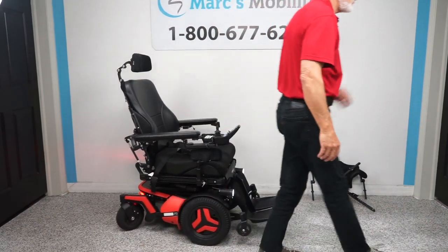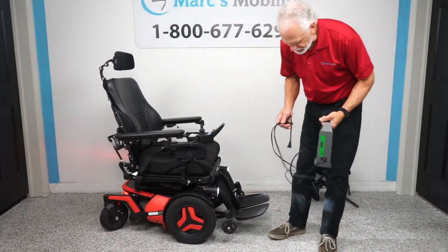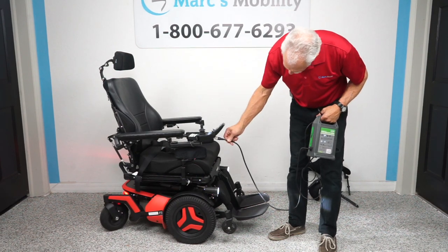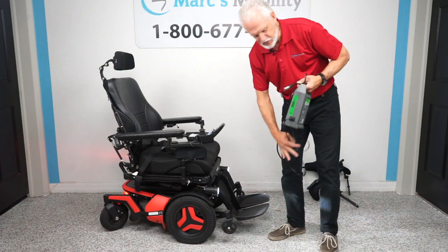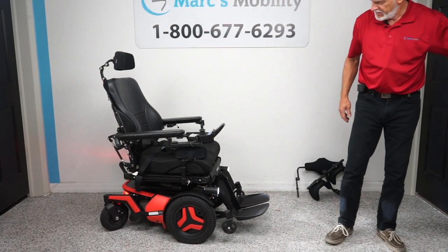When you charge this chair, take your charger and plug it right below the joystick. As soon as the light goes to full, the charger will stop charging — these are smart chargers that know when to stop. Let's recap.